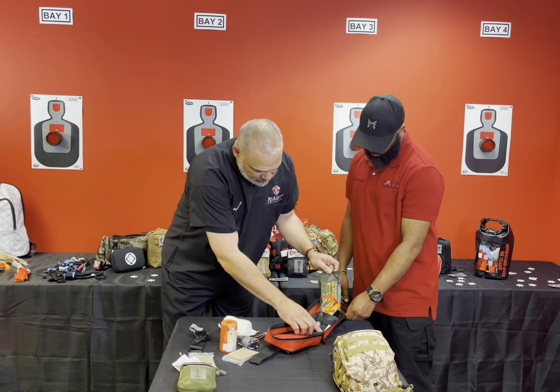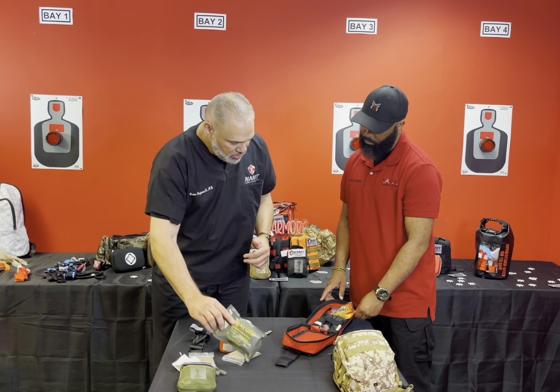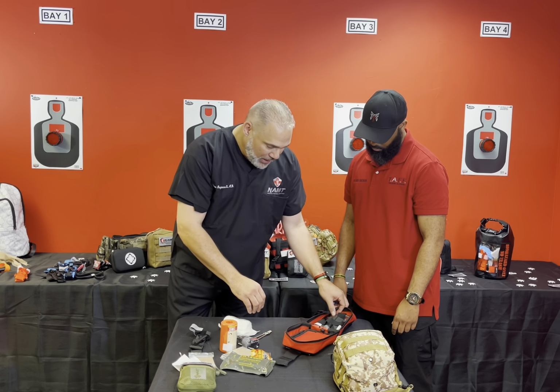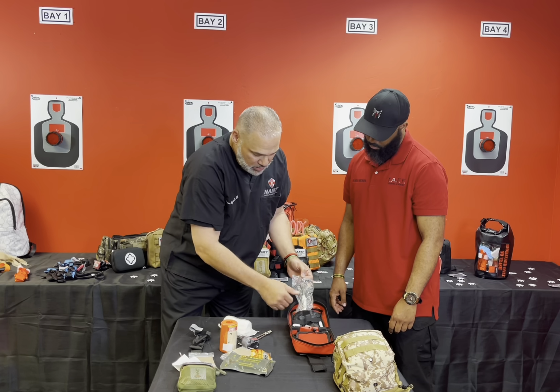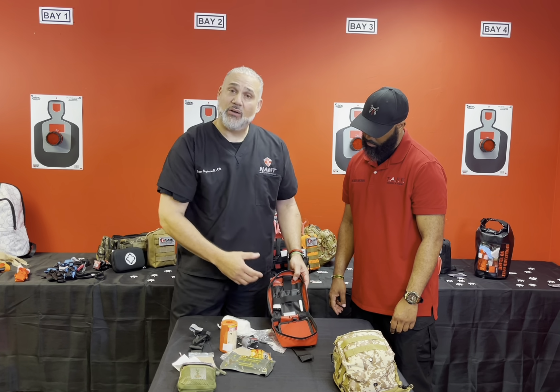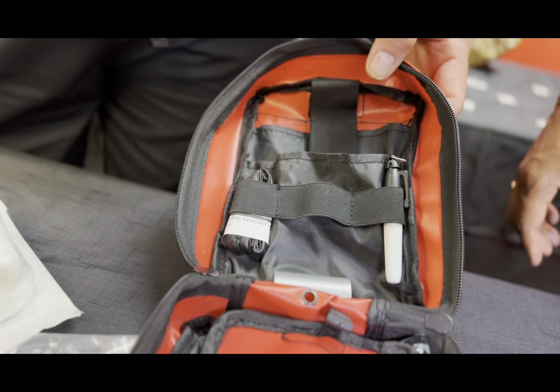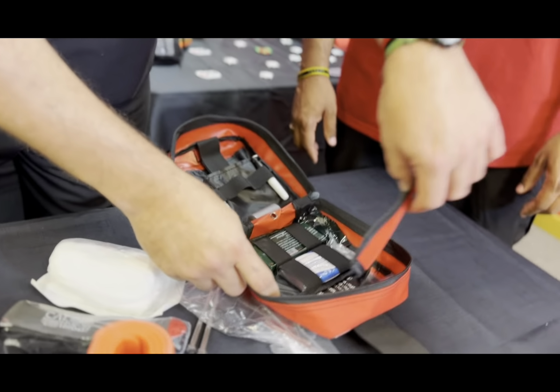This is your Celox gauze, very important to have, anti-hemorrhage. We always put in a hand warmer and an emergency blanket. Mylar blanket is what it's called, for hypothermia. You get a pair of trauma shears. You get a pair of nitrile gloves, and they're nitrile because, of course, we don't want people being allergic to latex gloves, so we try to stay away from the latex. You'll also get a marker to date, time, and stamp your tourniquet, all right?